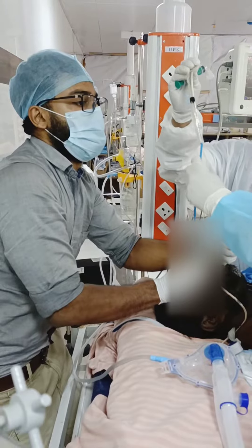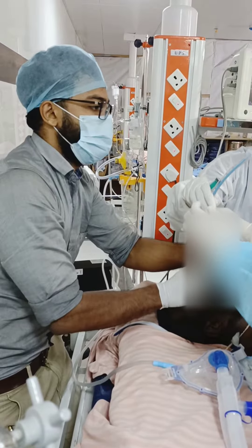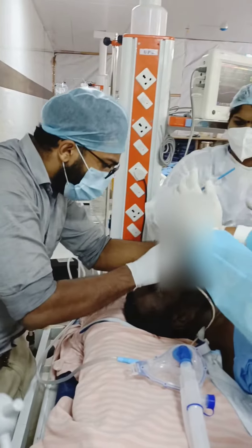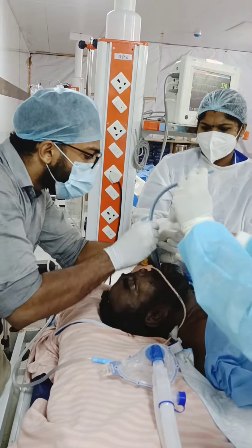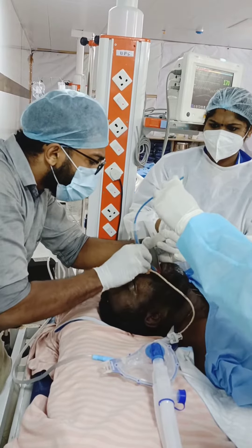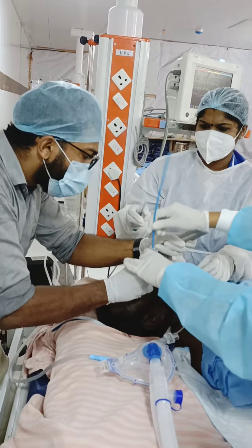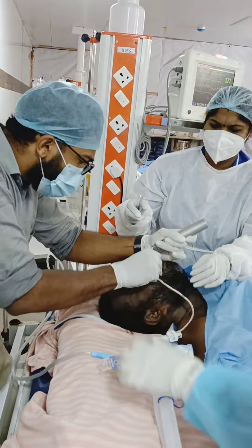Once you see the tip on the top, you hold it and push it down. Once the ET tube goes through the vocal cord, you are ready to pull out the Bougie.